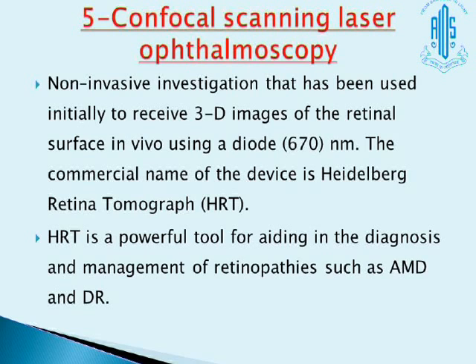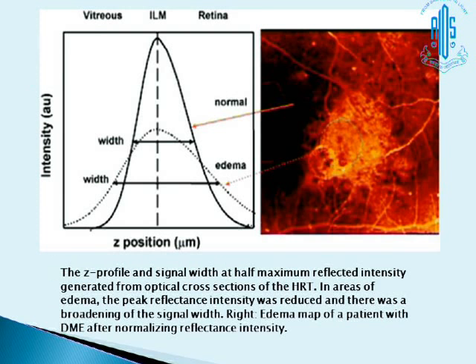The commercial name of the device is Heidelberg Retina Tomograph. HRT is a powerful tool for aiding in the diagnosis and management of retinopathy such as age-related macular degeneration. Look at this curve. The upper one is normal, whereas the lower one is wider and indicative of macular edema.